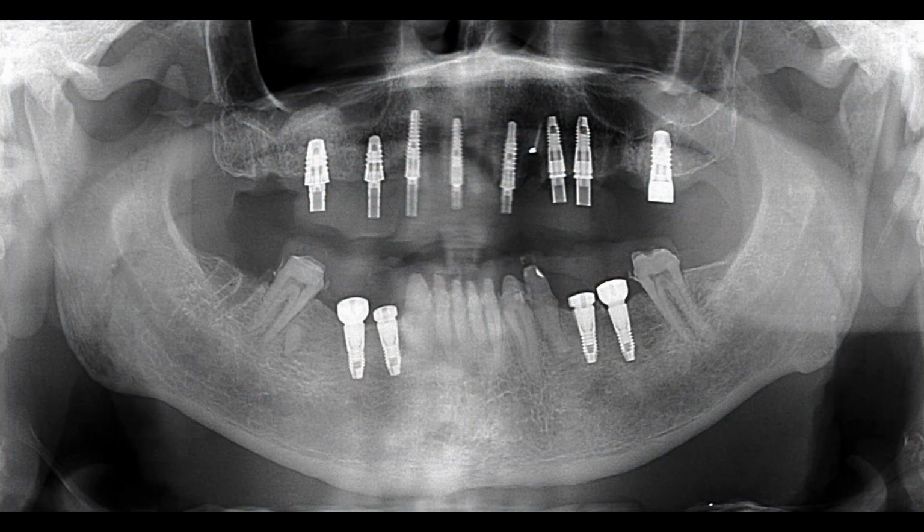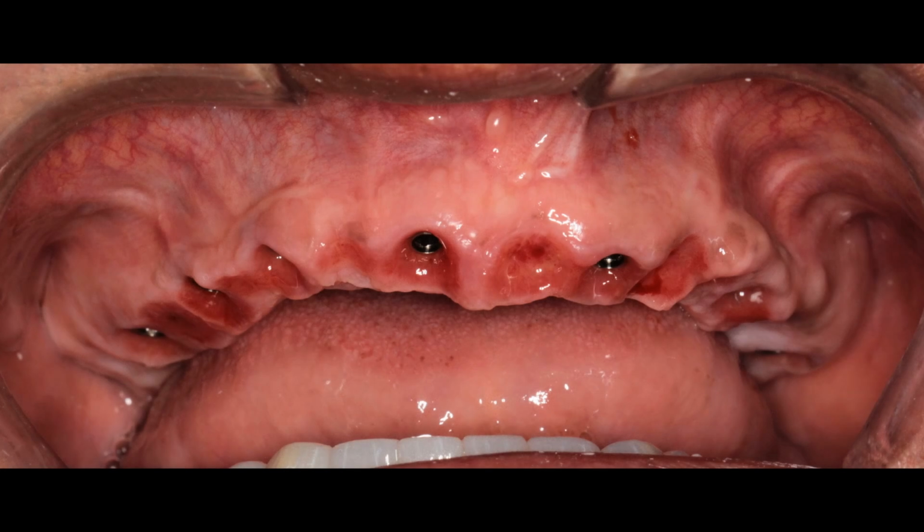You can see the bone graft we did in his right sinus and the additional 6 implants on the upper with the 2 that he already had. But remember the war-torn, ravaged dentition that he had when we started? I would consider this biotype to actually be excellent now, as if nothing happened in the past, which I wouldn't know unless I took all these pictures.